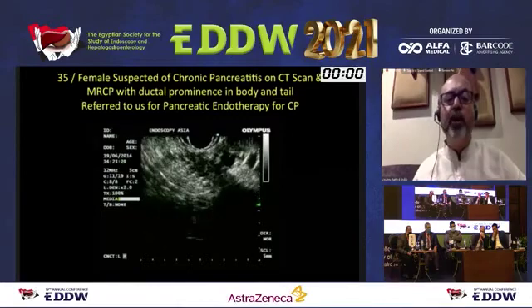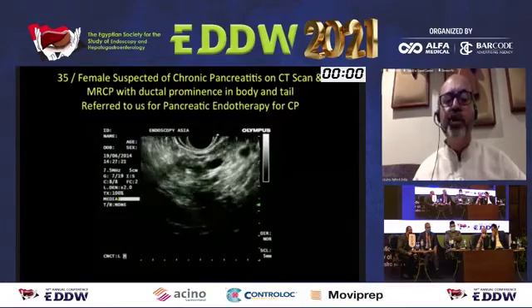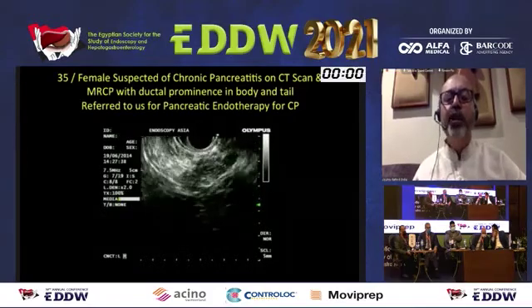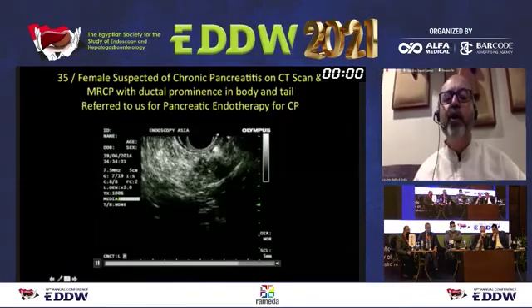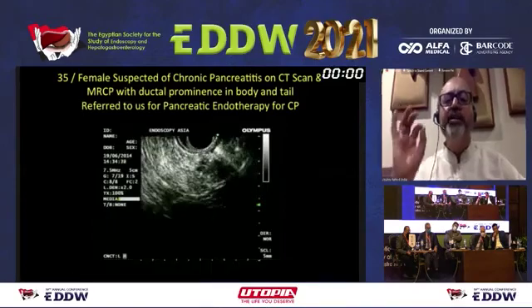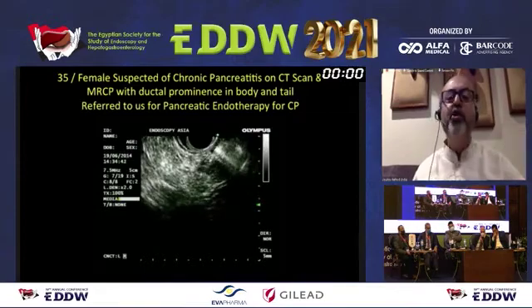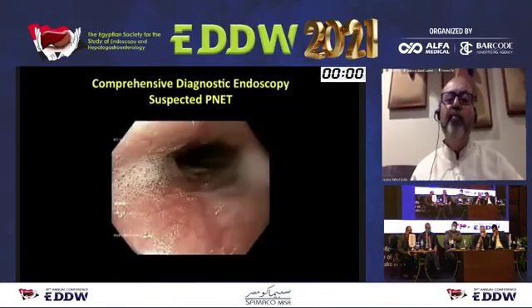I told them this is a tumor, you need to get operated, but since she was 35 and not prepared for a surgical resection, the surgeon insisted on FNA, and I used an EUS-guided FNA with a 25 gauge needle. A 25 gauge needle got me a diagnosis of ductal adenocarcinoma in a less than a centimeter lesion in the body of pancreas. So this is the magic of endosonography if you use it in its right context.